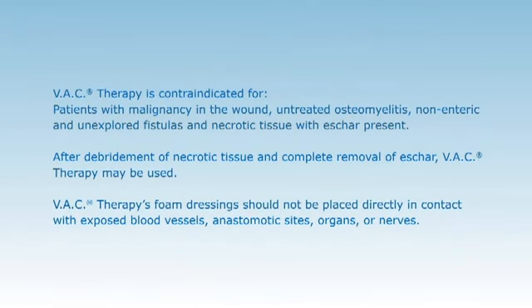V.A.C therapy is contraindicated for patients with malignancy in the wound, untreated osteomyelitis, non-enteric and unexplored fistulas, and necrotic tissue with eschar present. After debridement of necrotic tissue and complete removal of eschar, V.A.C therapy may be used. V.A.C therapy's foam dressings should not be placed directly in contact with exposed blood vessels, anastomotic sites, organs, or nerves.